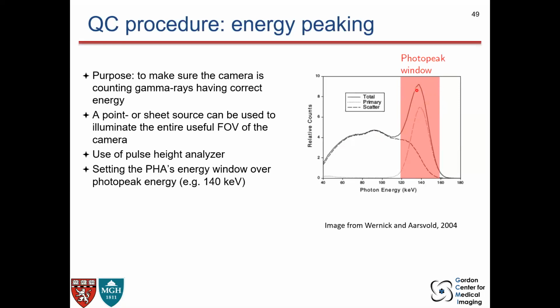That's the energy window, and within this range, you have to statistically acquire a relevant number of gamma ray events, and then apply curve fitting to make sure that your photo peak and energy spectra don't look weird.